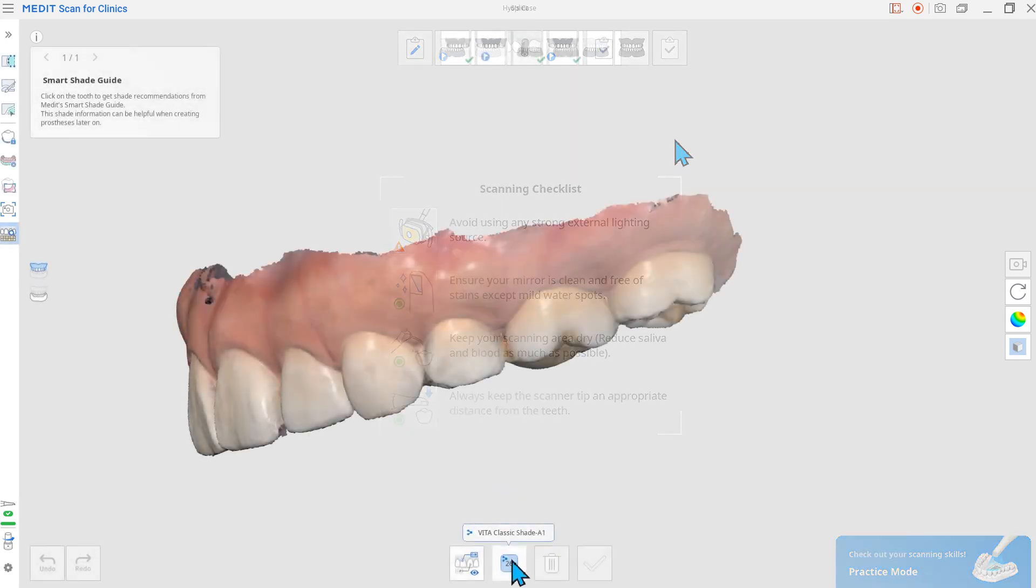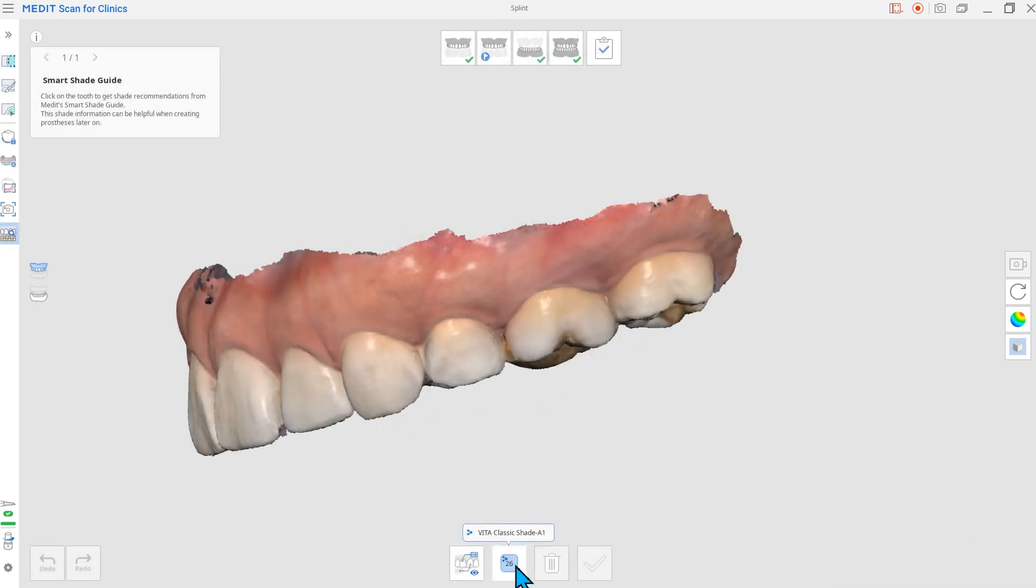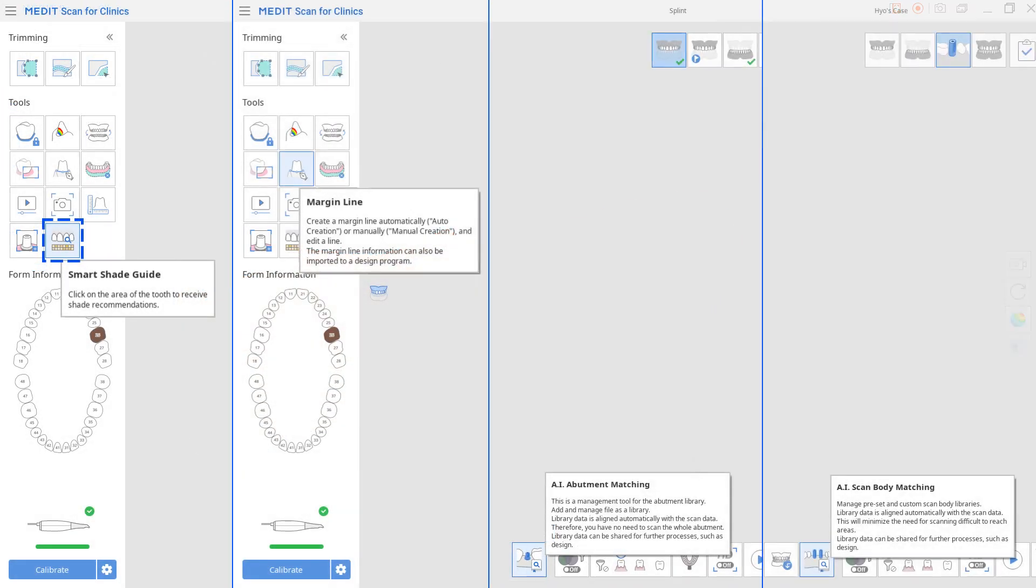We also improved teeth selection options for the following features: Smart Shade Guide, Margin Line AI, Abutment Matching, and AI Scan Body Matching.